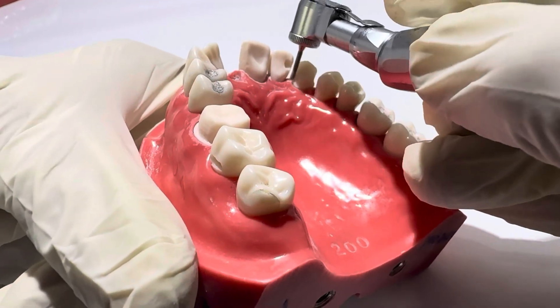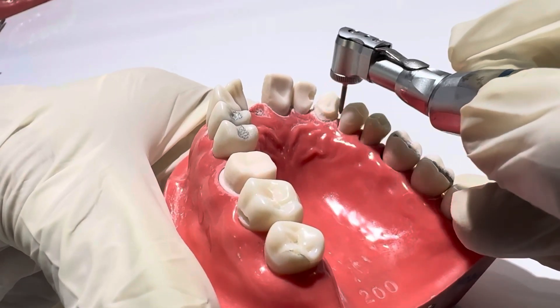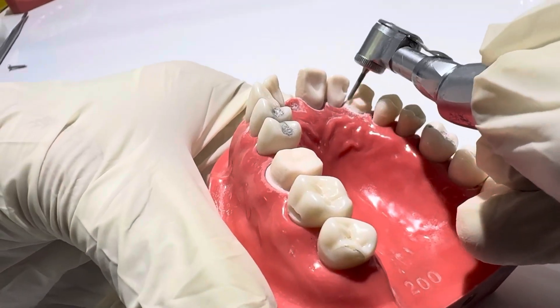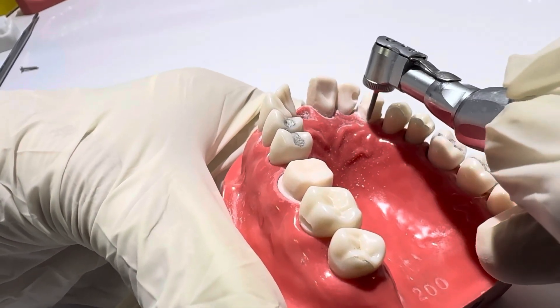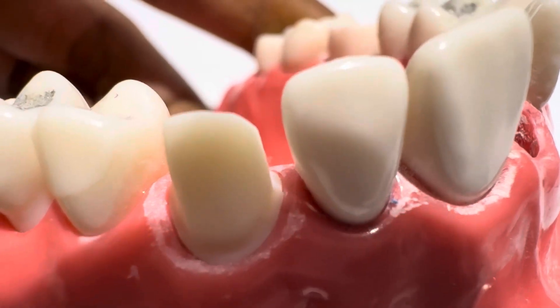Step 6: Finishing the preparation. Define finish line — chamfer for ceramic or zirconia; shoulder with rounded internal angle for PFM labial. Ensure 0.5 to 1.0 millimetres supragingival margin, unless subgingival is needed for aesthetics. Smooth all line angles and check for undercuts. Verify convergence angle of 6 to 12 degrees.